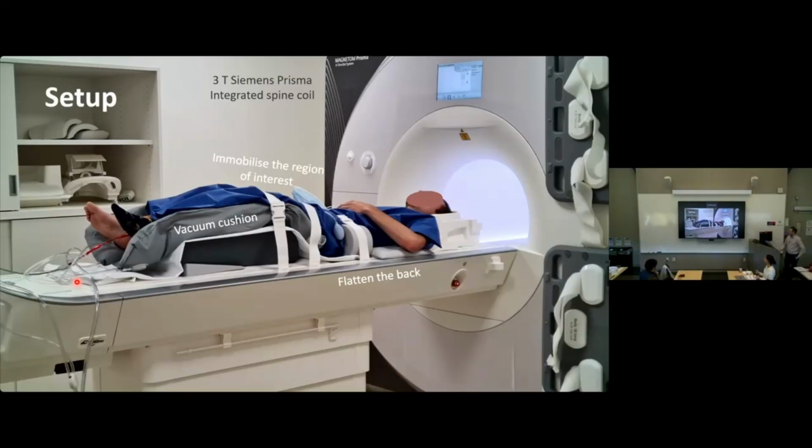So here you can see a setup for lumbosacral fMRI that we use. Two important things: you have to put a foam wedge below the leg, so you can minimize the lumbar lordosis. So the idea is that we flatten the back as much as possible. The second thing is that we want to immobilize the legs and the lower spine region as much as possible. For that, we use a vacuum cushion and different straps.